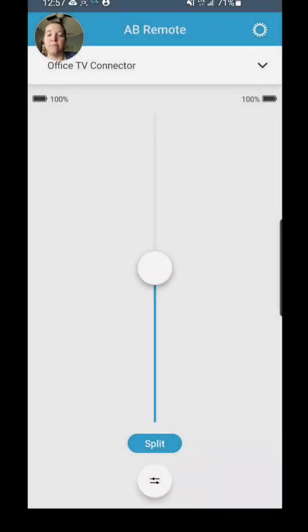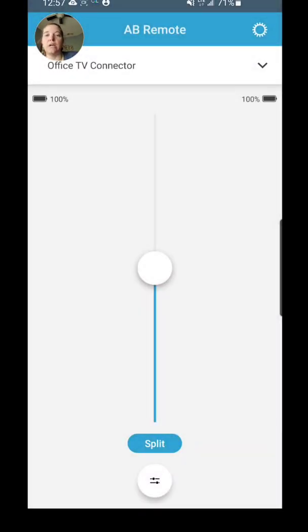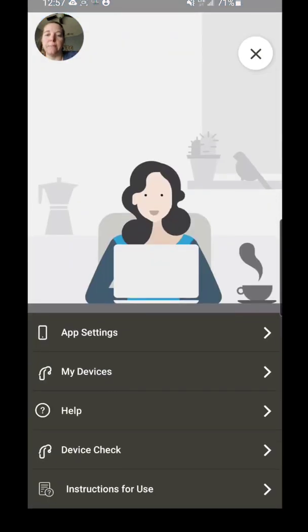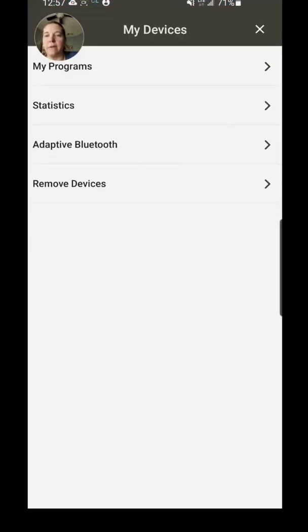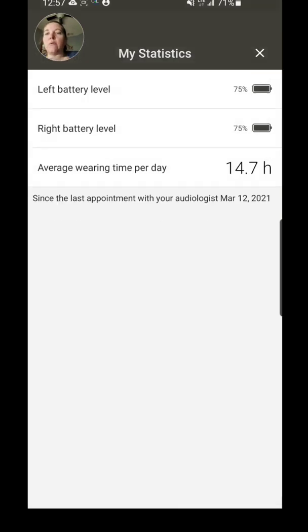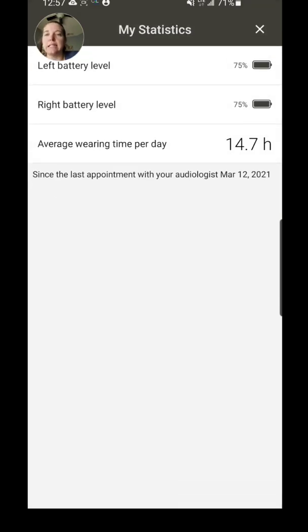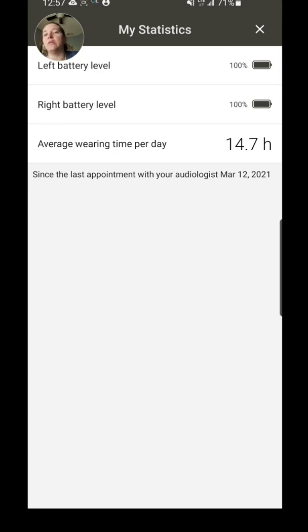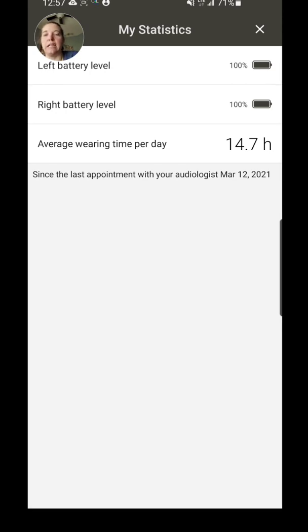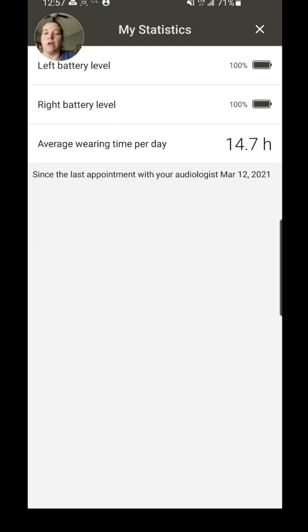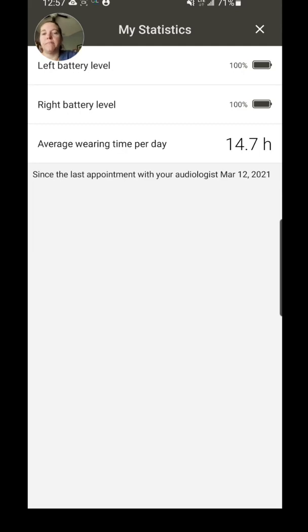So if we go back to this, the little cog wheel there, you can go back to My Devices. So we looked at My Programs, now we're going to look at Statistics. So this will show what my current battery level is and it also shows me what my average wearing time per day is, which is kind of cool to see, and when you were last seen by your audiologist.